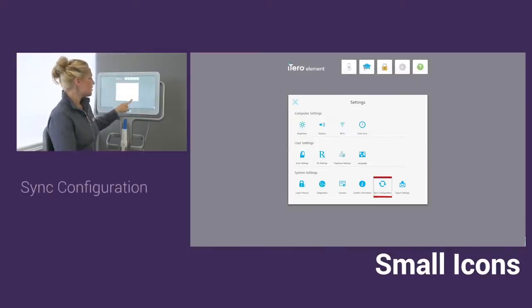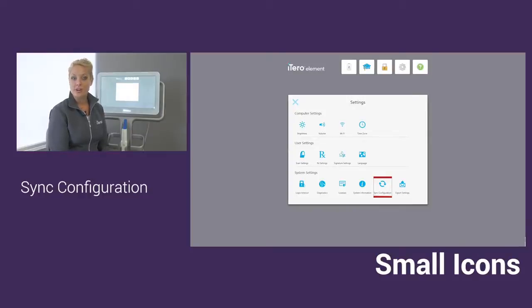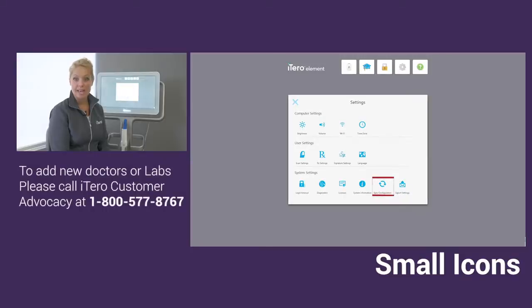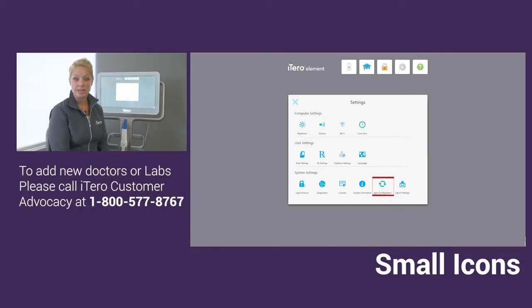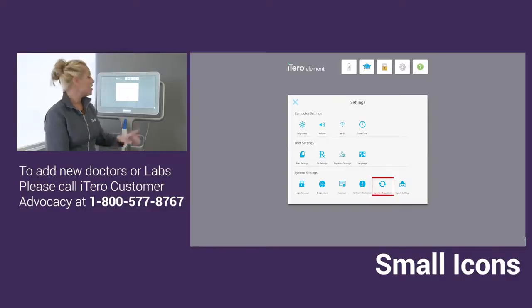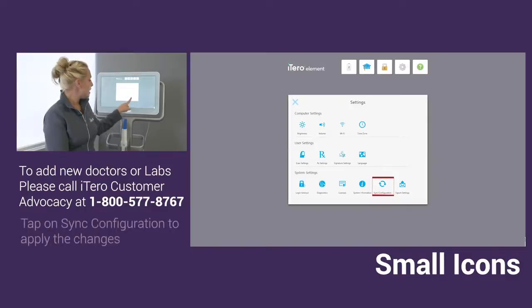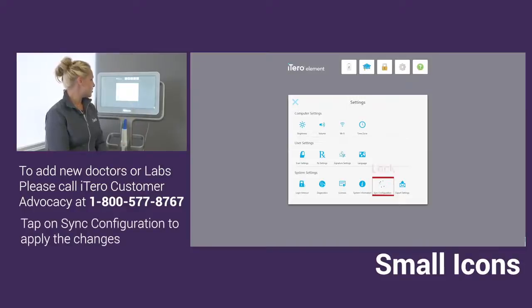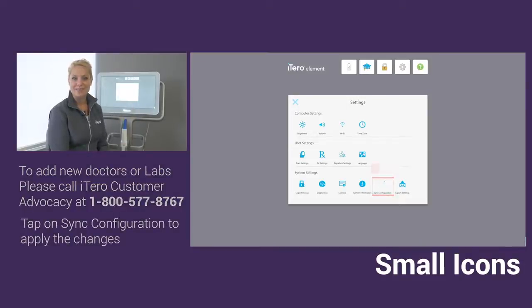Last, we have sync configuration. Whenever any changes are made to your scanner, for example, if you wanted to add another doctor or lab to your scanner, first you would reach out to Align Technology so we could apply those changes. And then for you to see the changes updated on the scanner, just tap on sync configuration and once the circles are complete, then your scanner is updated.